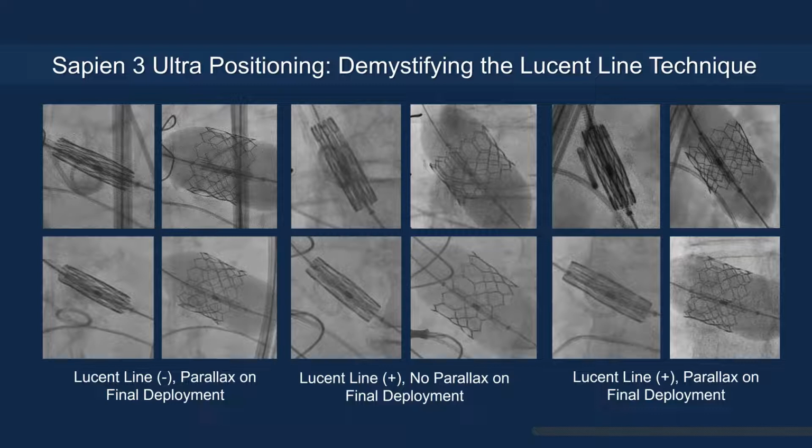So again, because of this, the Lucent line, in my opinion, is not an accurate guidance and reference point for a more aortic deployment. What we typically look at is the top of the valve, based on the percentage oversizing, degree of calcification, and inflation volume, to determine how much the inflow foreshortens and your target implant depth.